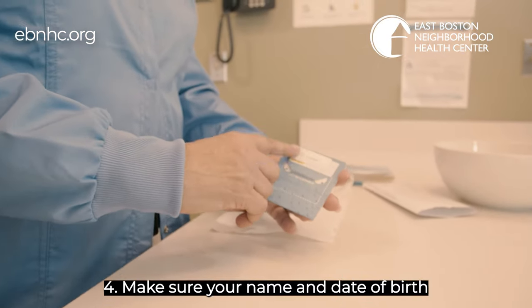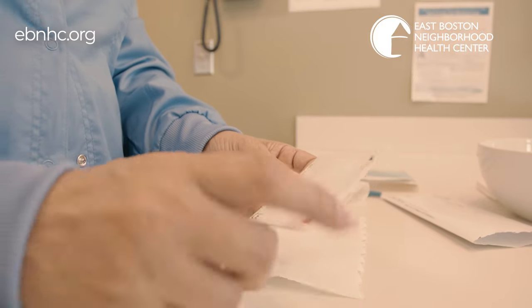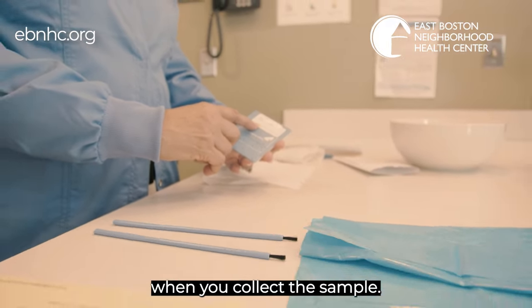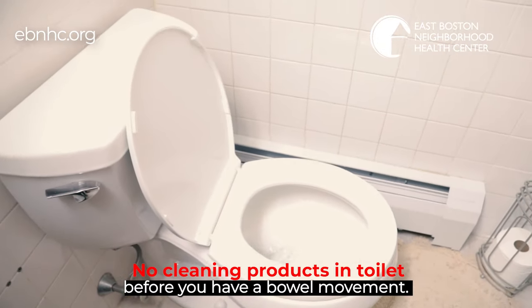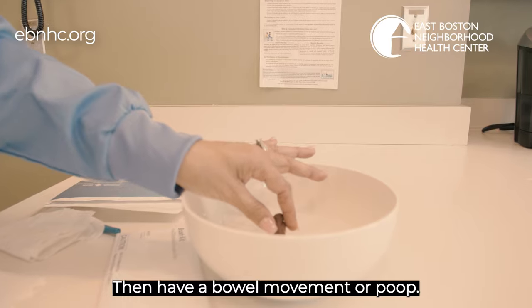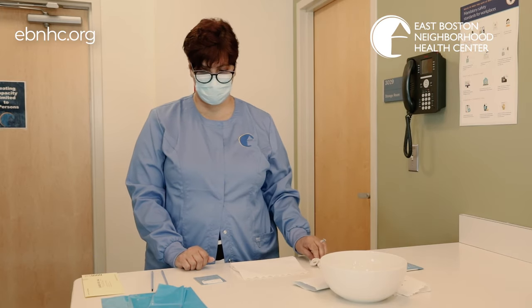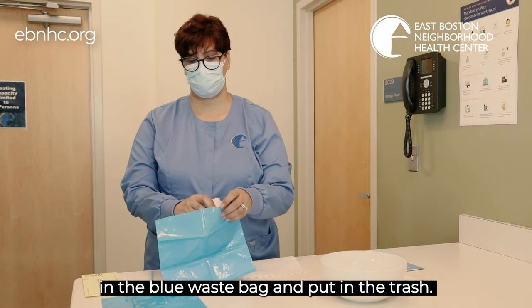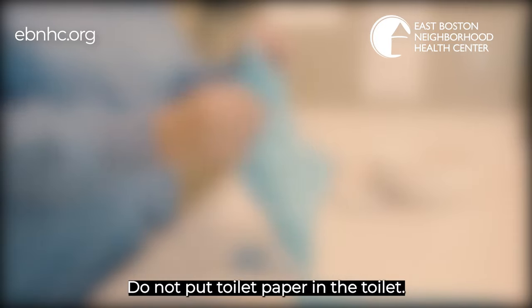Step 4: Make sure your name and date of birth are printed on the label. Remember to fill in the date when you collect the sample. Step 5: Flush the toilet before you have a bowel movement, then have a bowel movement or poop. Step 6: Place the used toilet paper in the blue waste bag and put it in the trash. Do not put toilet paper in the toilet.